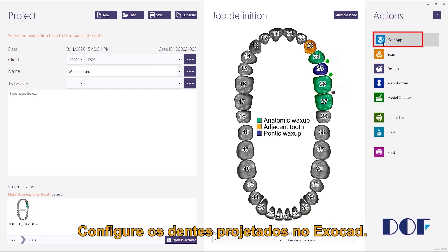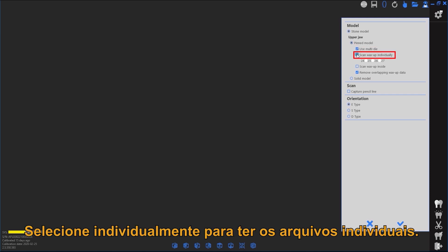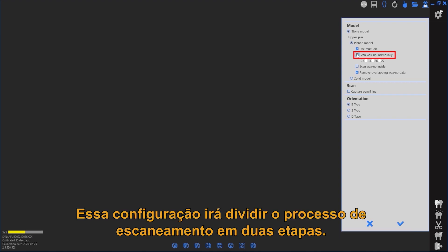Configure the project teeth indications as wax-up in Exocad. Select the option to use multi-die as desired. Select to scan wax-up data independently — this configuration will divide the wax-up scan into two separate steps.